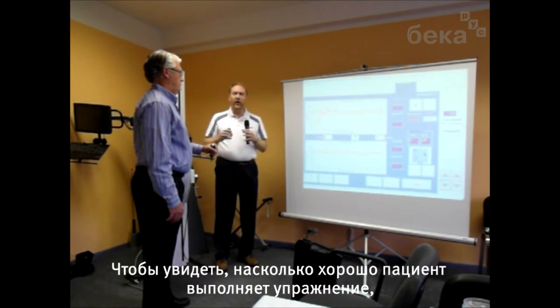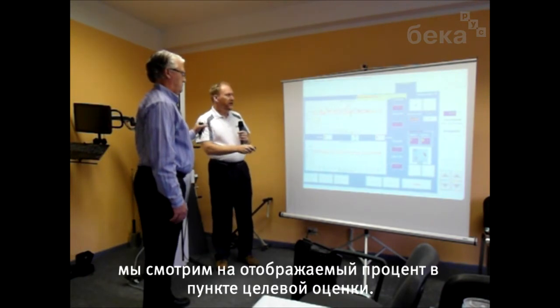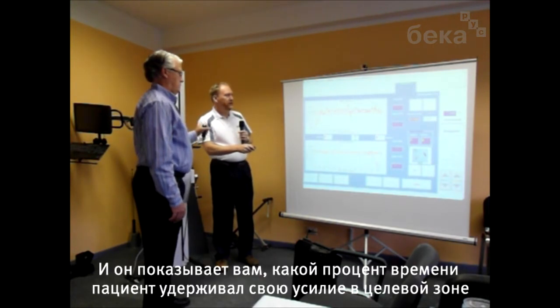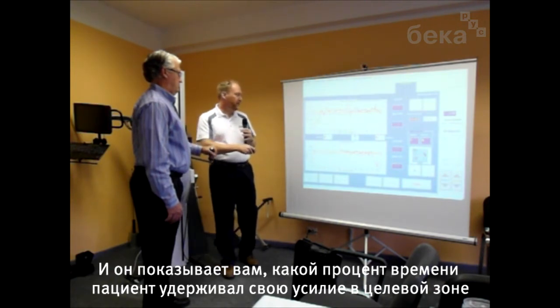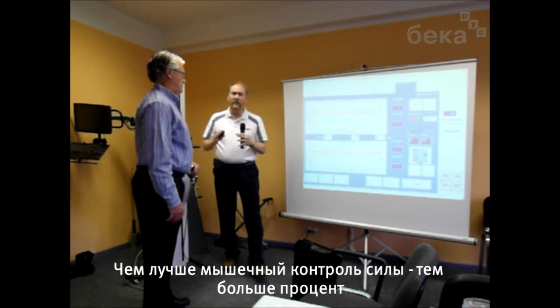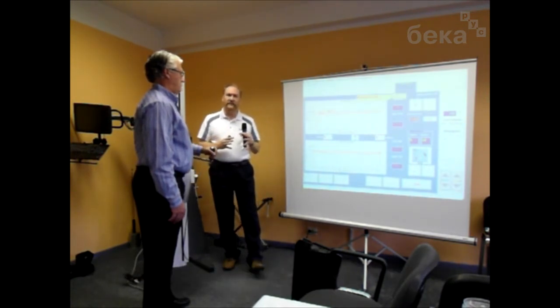To monitor how well the person is able to perform that activity, we look at the percent on target score, and this shows you what percentage of the time the person is able to keep their force output inside that designated target range. The better motor control they have, the higher percent accuracy they'll have.